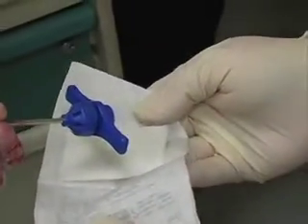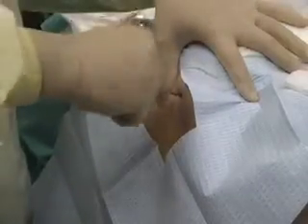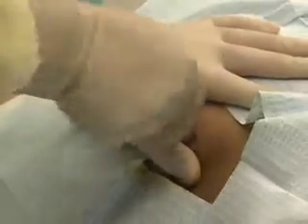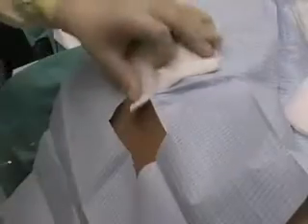Removal of the biopsy needle without breaking off the core specimen is a common problem. In this case, reinsert the biopsy needle, ensure that the specimen has been detached from the surrounding marrow before removing the needle, and be sure to remove the biopsy needle slowly while continuing to rotate the needle. If the core specimen is too small or contains too much cortex and too little marrow, consider obtaining an additional biopsy specimen.